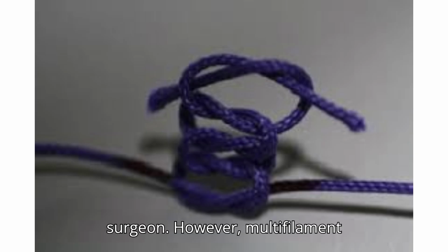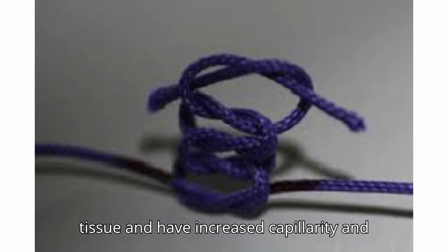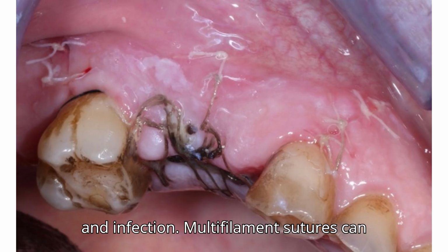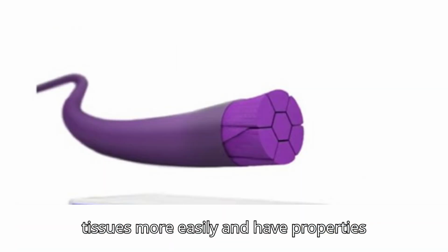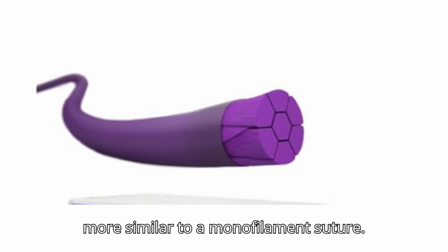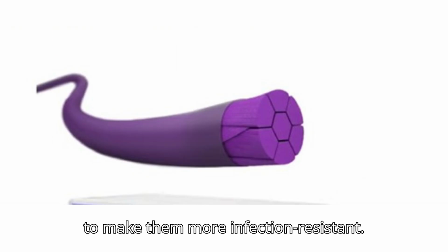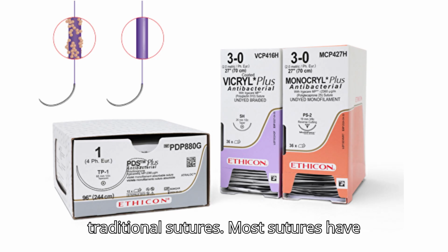However, multifilament sutures also cause more friction through tissue and have increased capillarity and surface area, making them more prone to inflammation and infection. Multifilament sutures can be coated to make them slide through tissues more easily and have properties more similar to a monofilament suture. They can also be coated with antibiotics to make them more infection resistant. However, they are more expensive than traditional sutures.